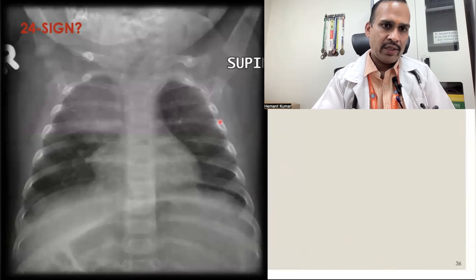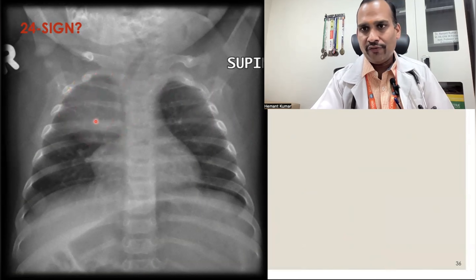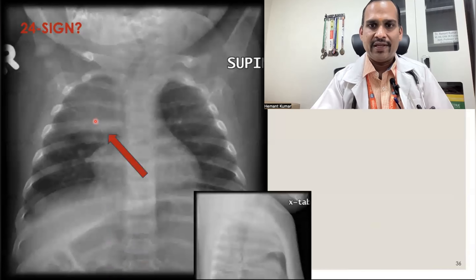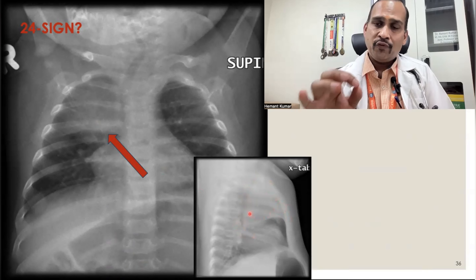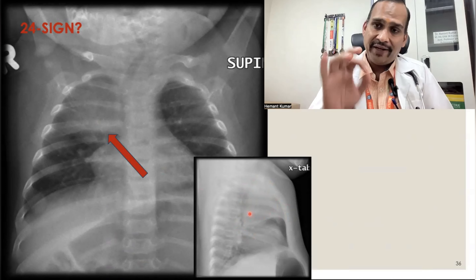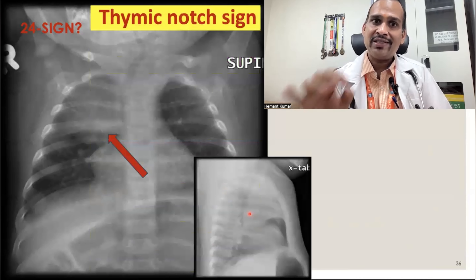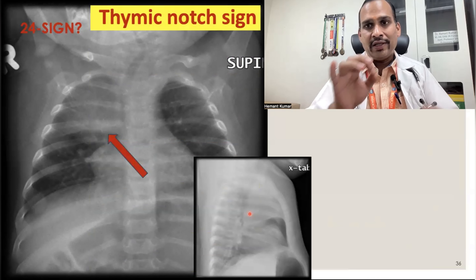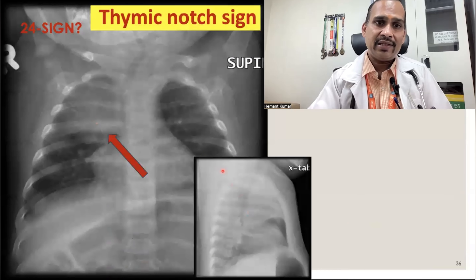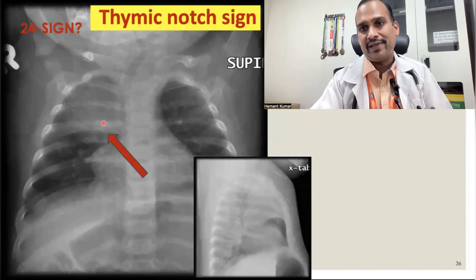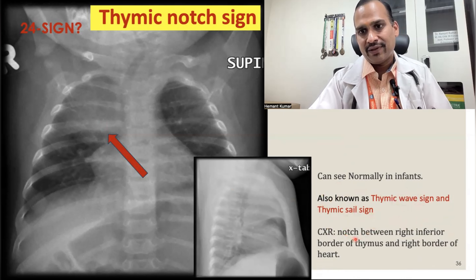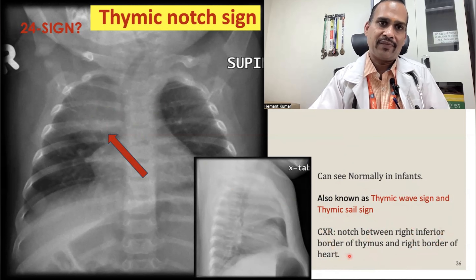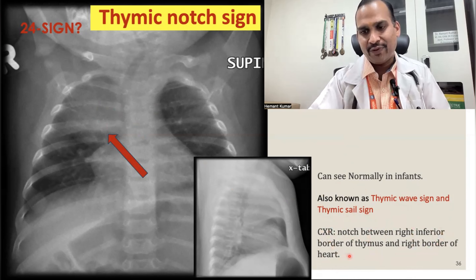Sign 24 is the thymic notch sign. You can see opacity in the upper zone of the right lung; on lateral X-ray, there is opacity in the upper lobe. If you find this type of X-ray in an infant less than 1 year of age, this is normal — it is normal thymus. It is also called the thymic wave sign or thymic sail sign. The notch is found between the right inferior border of the thymus and the right border of the heart.